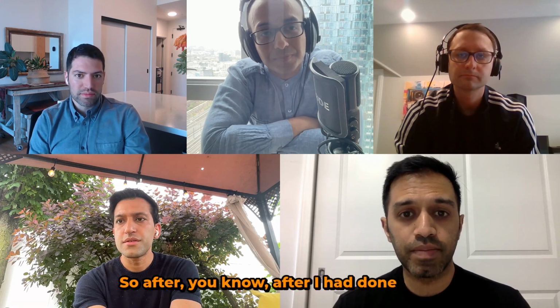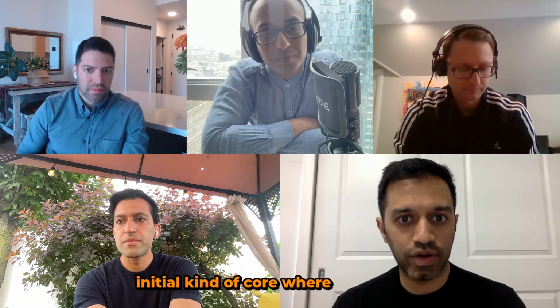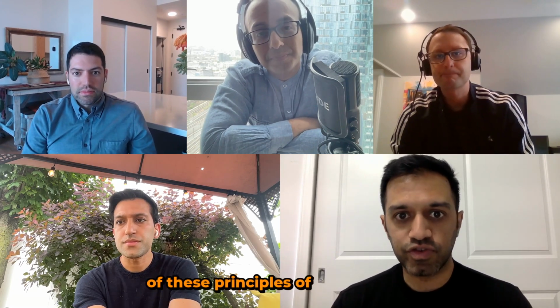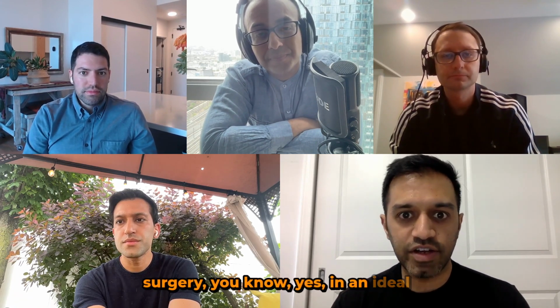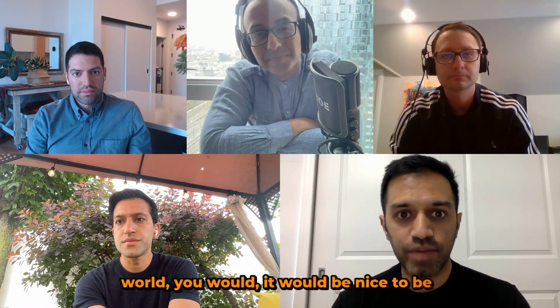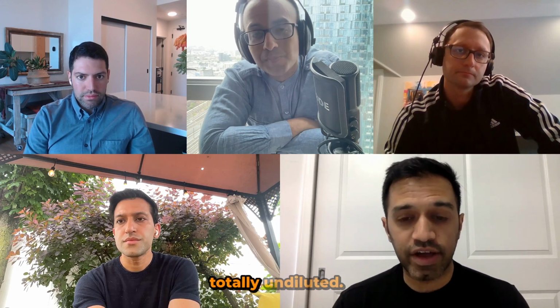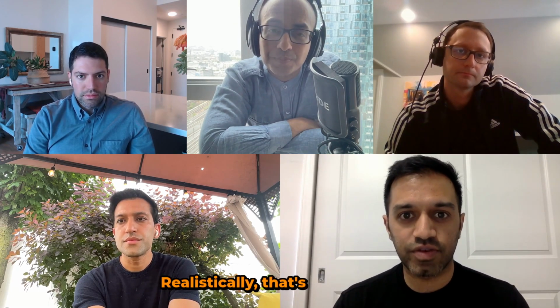Well, you turned the infusion on halfway through, right? You were fully on. Yes. So after I had done that initial core, where you're just cranking things up, at the end, you're still going to adhere to some of these principles of vitreoretinal surgery. Yes, in an ideal world, it would be nice to go directly to the nerve, lift the hyaloid, induce the PVD and get that posterior vitreous cortex that's attached to the retina totally undiluted. Realistically, that's somewhat challenging to do.